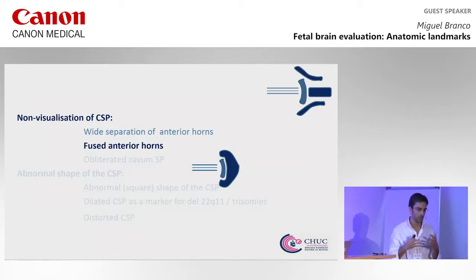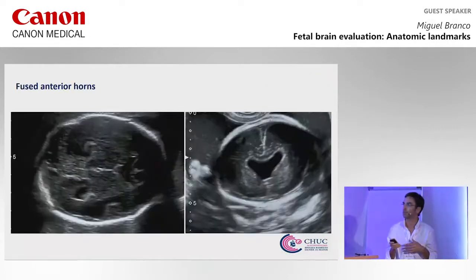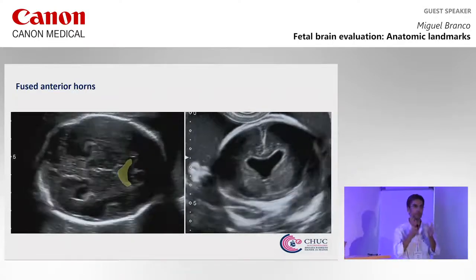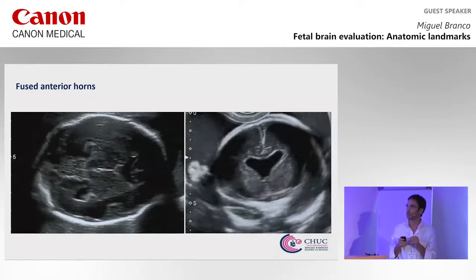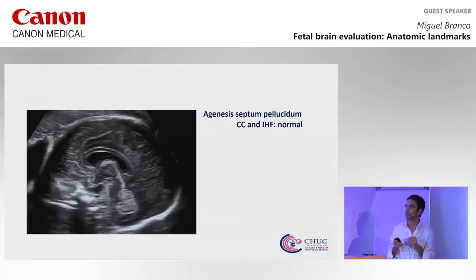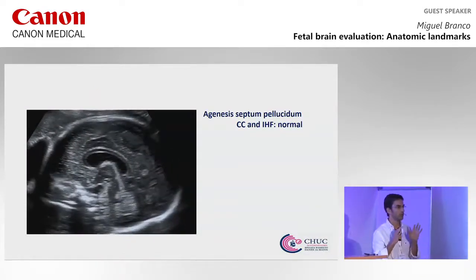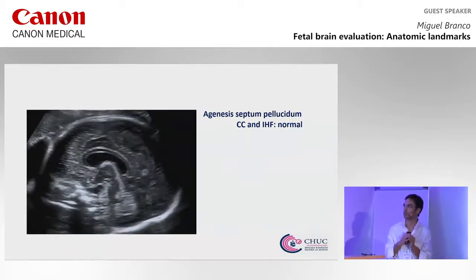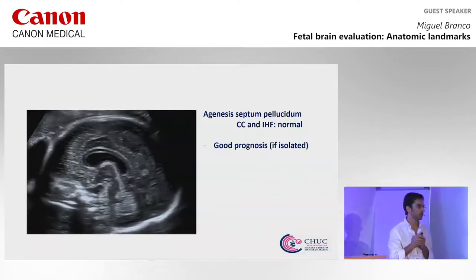Another group: we don't have a CSP and we have anterior fused horns. Like in this case, in coronal evaluation we are not able to see the leaflets of the CSP. If we have an otherwise completely normal evaluation, this could be agenesis of the septum pellucidum, which is most frequently associated with a good prognosis.